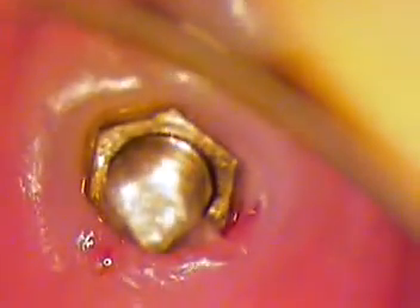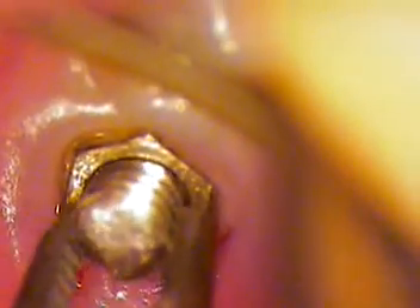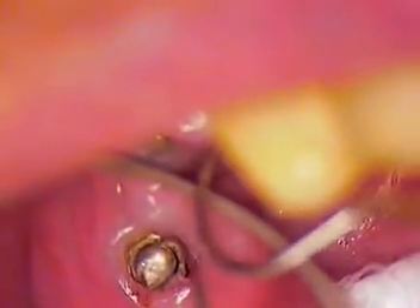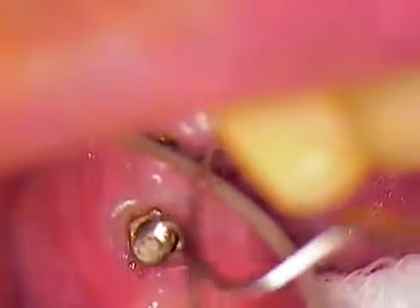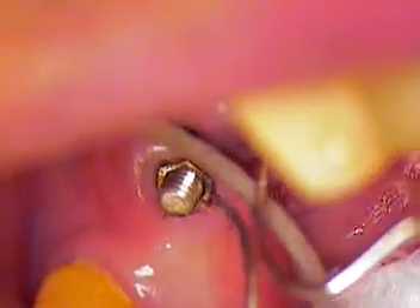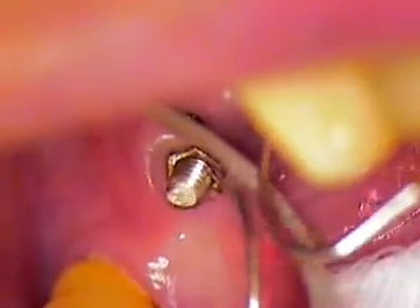We'll pick it up with a pair of cotton pliers. I'm going to use an even more blunt end instrument — see if I get a little better rotation and a little more contact. I just play around and try to find out which instrument works best. I like the explorer. You can see already there's four or five threads still unscrewing. There's a fifth thread coming up — we may have six total underneath. There it is.